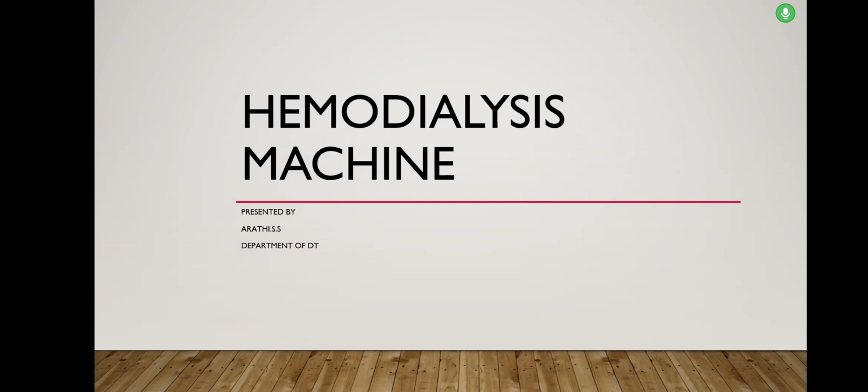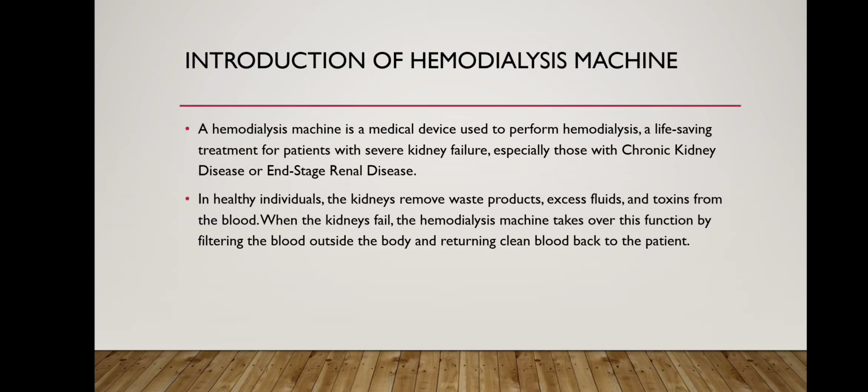Hi everyone. Today we are going to discuss the hemodialysis machine. First one, introduction of the hemodialysis machine.